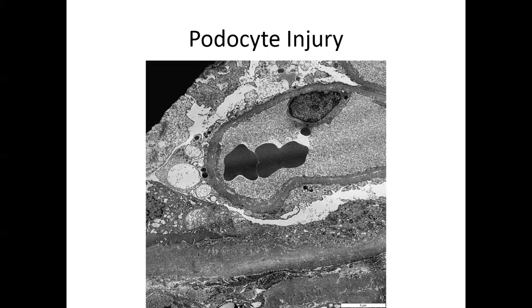And some of those same antibodies, used to look at the presence or absence of autophagic vacuoles, have been applied to human renal biopsy material, and they have seen a decrease in autophagy in human renal biopsy material with this diagnosis. So it's probably the new, hey, let's try to promote autophagy as a new drug.